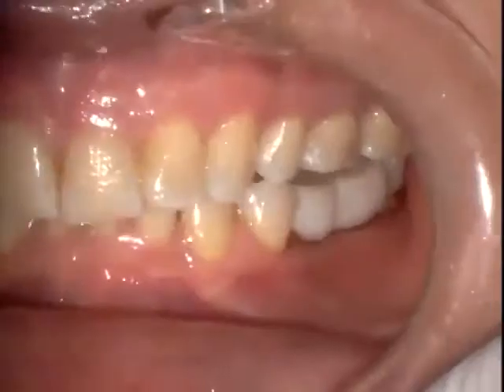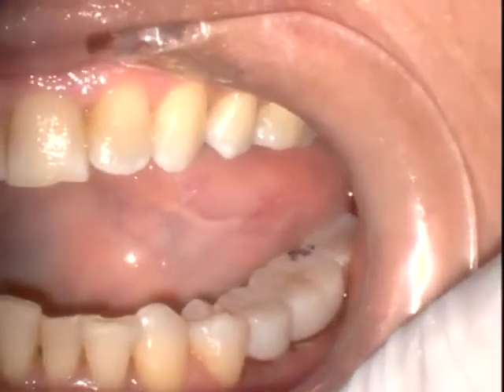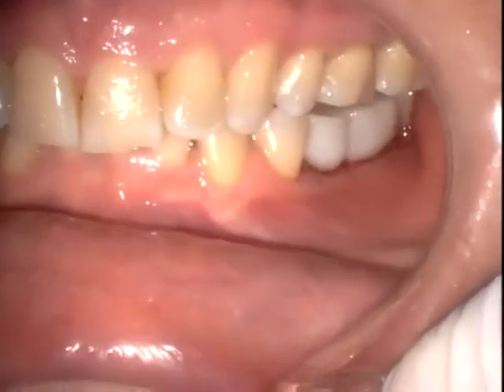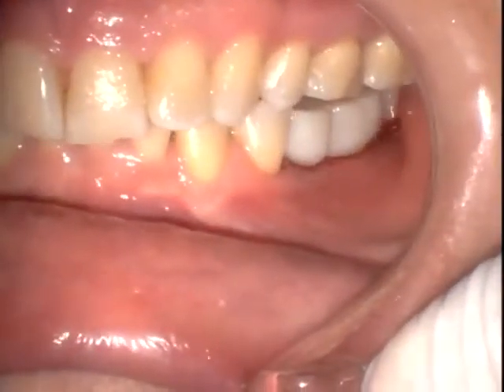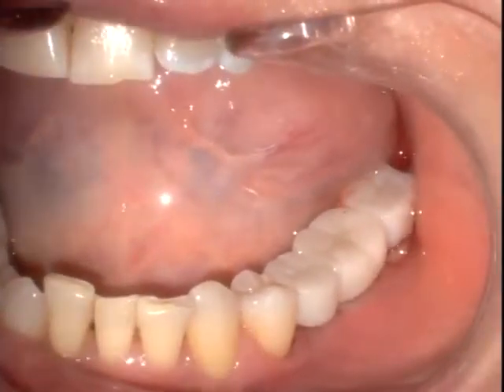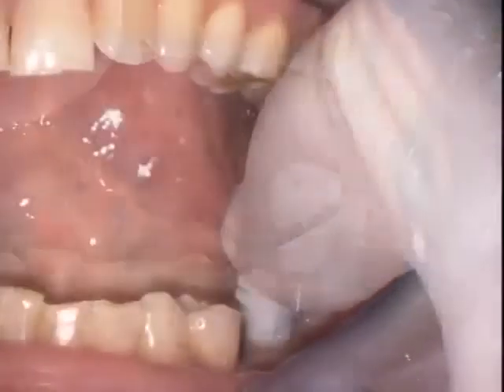Temporary restoration is then carved chairside and inserted, and then checked to make sure that there is no contacts. And you can see the slight contact on the distal lingual of the first molar. We're going to make sure that we carve that away so there's no contacts in centric or in excursive movements. PRGF material is then syringed around the remaining sutures, and we cement only with antibiotic ointment. No traditional dental cements are utilized.